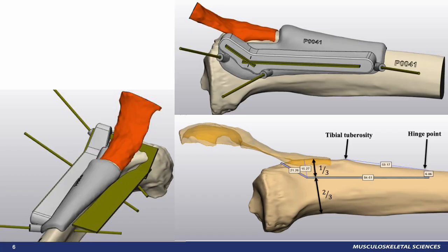An 85mm cut is planned to be made from distal to proximal before angulating anteriorly to make an oblique cut of approximately 20mm. 60mm of length between the tibial tuberosity and hinge point will be set aside for the insertion of 2 screws, which are planned to be inserted at 20mm and 40mm distal from the tibial tuberosity respectively.